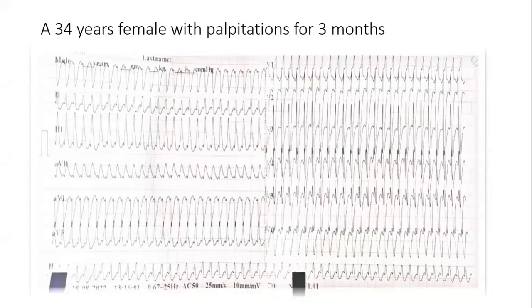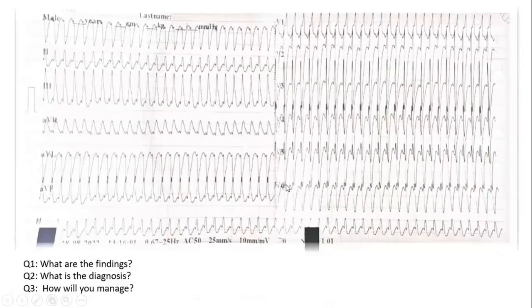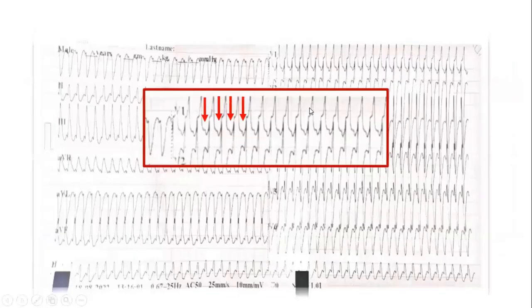This is a broad complex tachycardia, fairly regular, with right bundle morphology coming from LVOT — this looks like LVOT VT. Let me give you a hint and zoom in. Now what do you think is happening? I'll zoom in on lead V1. There are some humps, you can see those humps over here as well, and they are definitely not part of a QRS. What do you think about this — are these retrograde P waves?